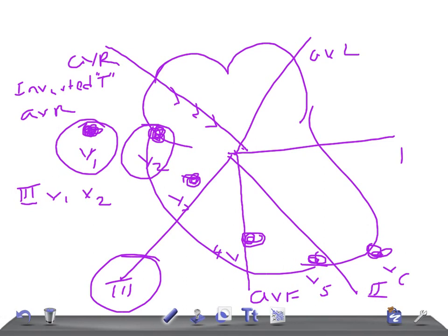Today we're talking about whether T waves are too tall. The questions to ask when looking at T waves are: are they too tall, too small, or inverted? We know the normal inversions occur in AVR, V1, V2, and lead 3. As for height, unlike the R wave rule of 25 mm, there is no strict general rule for T waves — but the T wave should not be more than half the size of the preceding QRS complex.